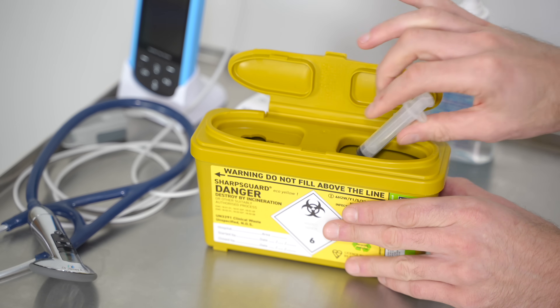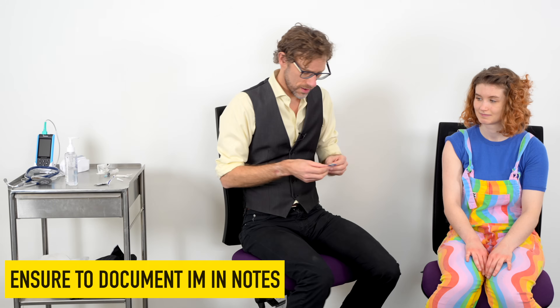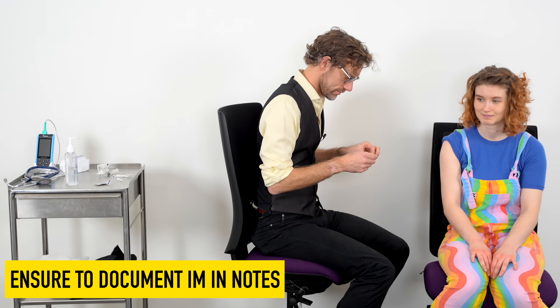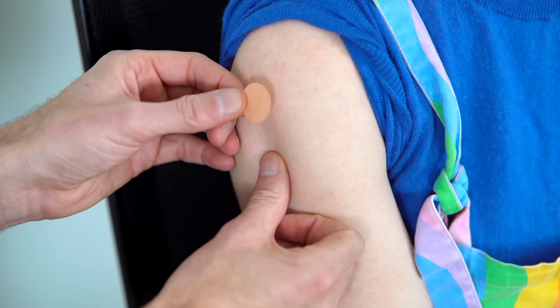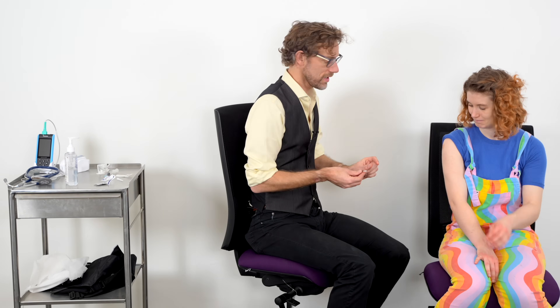So we're going to put that in the sharps bin, and I'm just going to sort out your plaster — and just putting that over the site of the wound. Super, you can pull your shirt back.